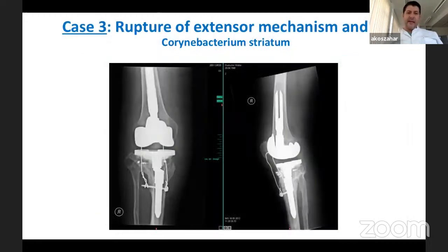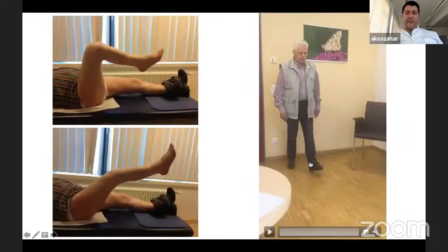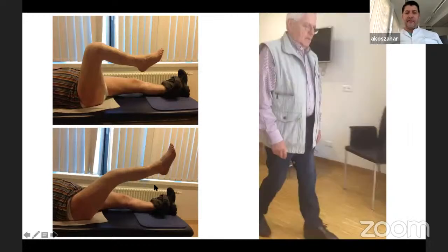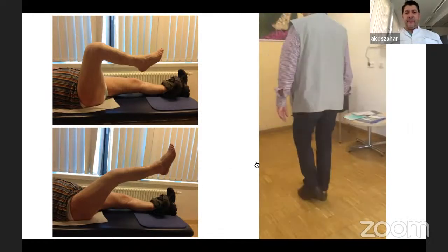This is also a very nice case with a total knee replacement with the rupture of the extensor mechanism, a lot of hardware, and bad soft tissues, and it was operated in one stage, reconstruction of the joint line, reconstruction of the bone defects. You can see nice central patella alignment and antibiotic bone cement. The patient had only a very small amount of extension lag, but was able to walk without crutches even after this quite big disaster in the knee.